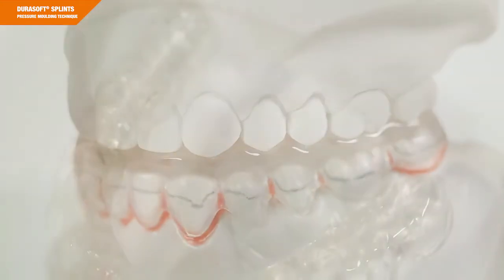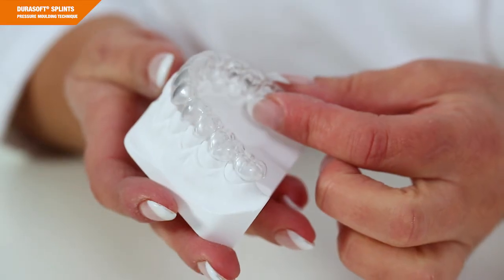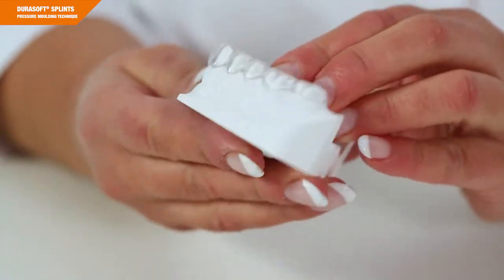This guide applies to the fabrication of occlusal splints with or without adjustments. The fabrication procedure is similar for both kinds of splints. The choice of the right thickness depends on the individual indication. I'll mention any differences in the fabrication when I get to the corresponding step in the video. At the end of the video, you'll be able to prepare splints made of DuraSoft on your own.